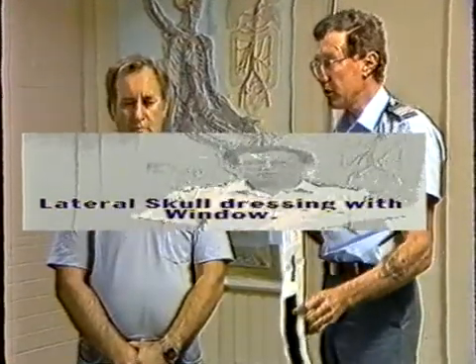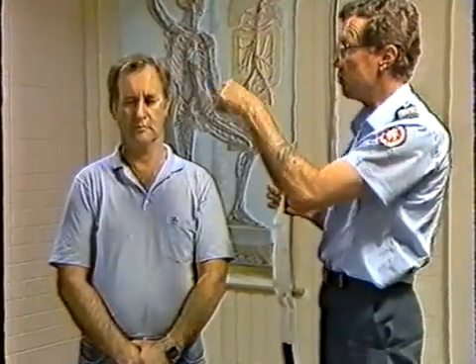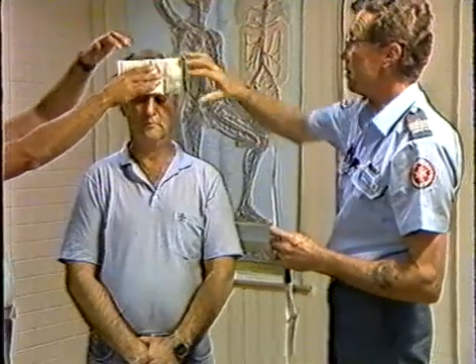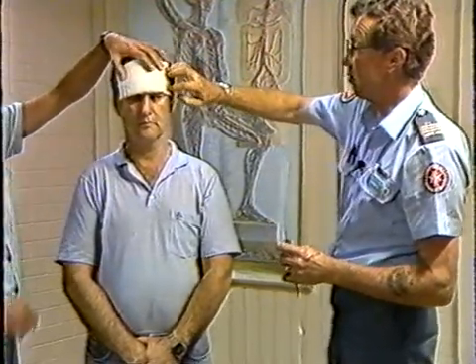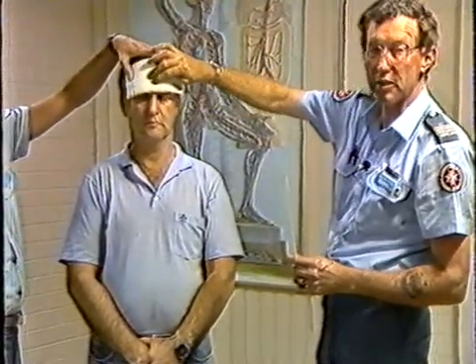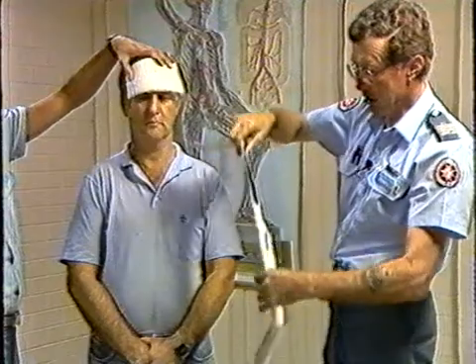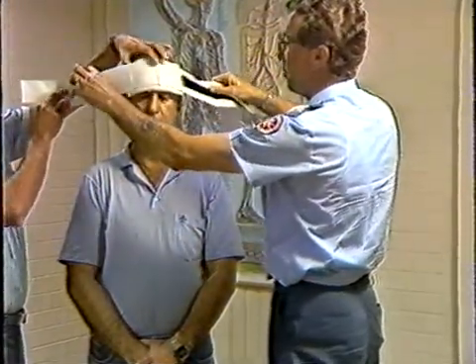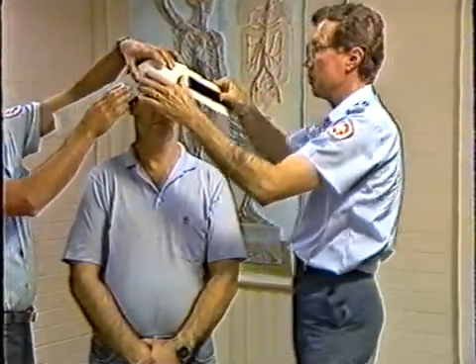So this one has been specially made with a window in the centre for a couple of reasons, and one of them is for the application of lateral dressings on the skull, which sometimes can be quite difficult to put on and maintain there with a variety of triangular bandage knots and procedures. So this one we'll say the laceration is on the forehead. We take the bandage and make sure that the window is across where the laceration is under the bandage.